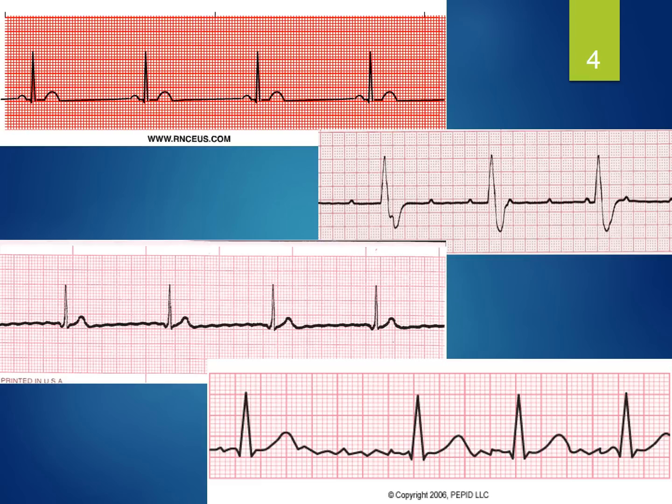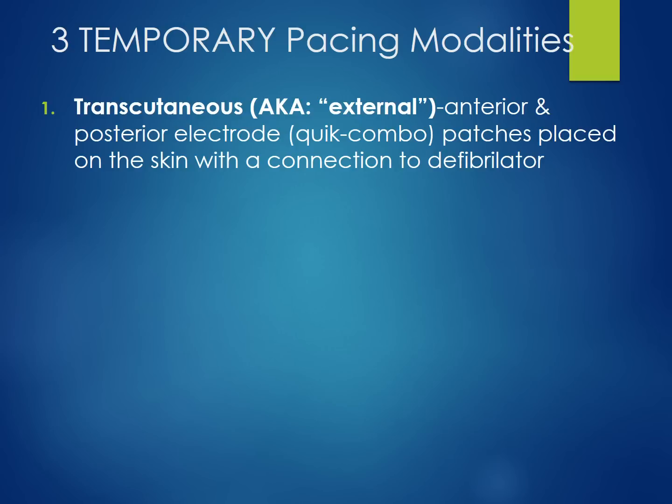And remember, we're not only concerned about the heart rate itself, because we have rates of 30 and 40 here, we're also worried about what our patients look like. Yes, these rates are slow, but is that enough to perfuse our patient's organs? What are we going to see in our patient if this is not enough, if we're having symptomatic bradycardia? Now, we've determined that anyone with symptomatic bradycardia might need pacing. Now, how do we pace a patient? How do we send that little electrical jolt to their heart at that set rate of 80, 90, sometimes 100 beats per minute? How do we pretend to be an SA node in a sense?